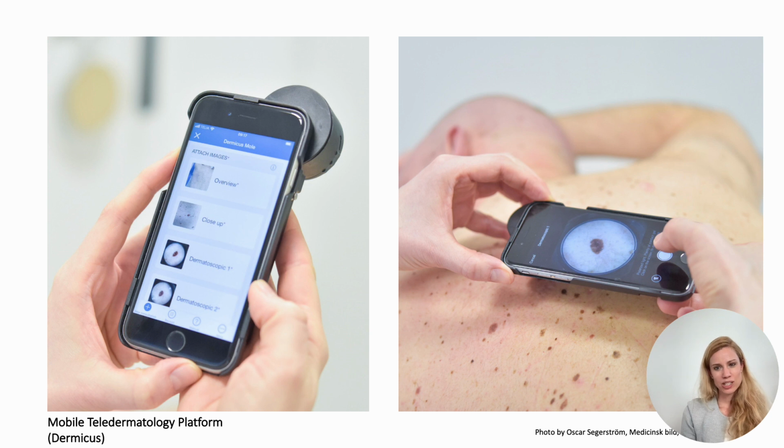So how does teledermatoscopy work at a primary healthcare center? As a GP, if I encounter a suspicious skin lesion on my patient, or if I'm uncertain about a skin lesion, I can create a referral within the patient's medical record. I can then securely log into a dedicated mobile, retrieve the referral I just sent, and capture pictures following a specific protocol, both from a distance and using dermatoscopy. I then send a referral with the pictures from the mobile for review.